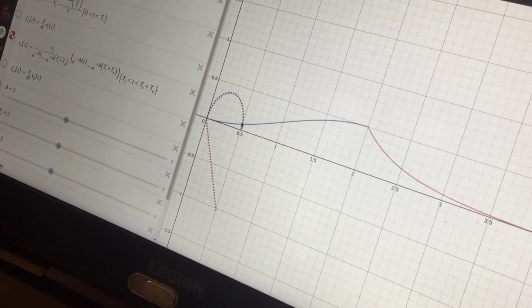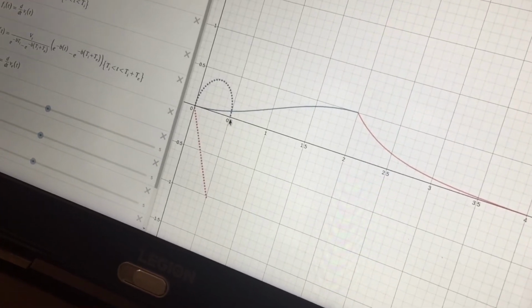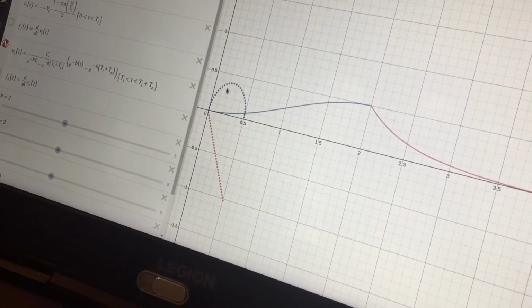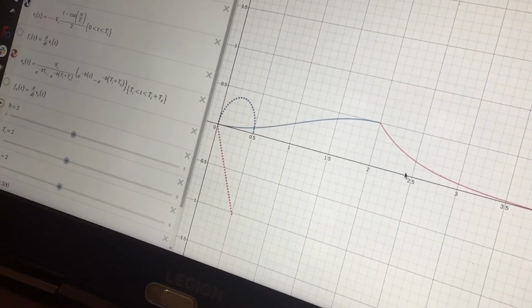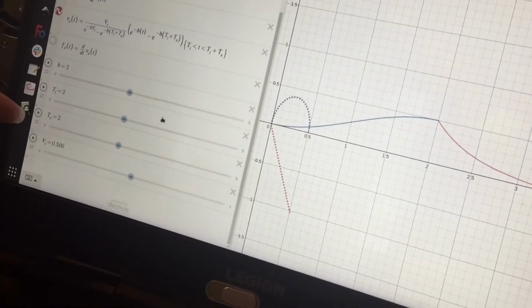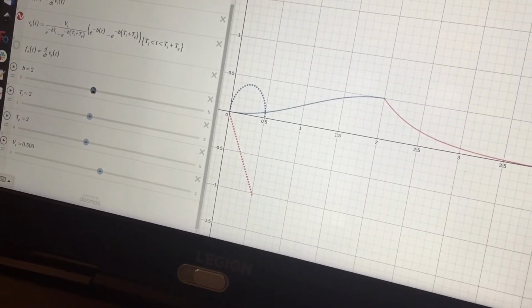Flow loops are pretty common in spirometry, the measurement of breathing. So this will automatically map my breathing flow loop to my function versus time, and that's what some of these equations over here are doing. And then I have some variables I can play with.